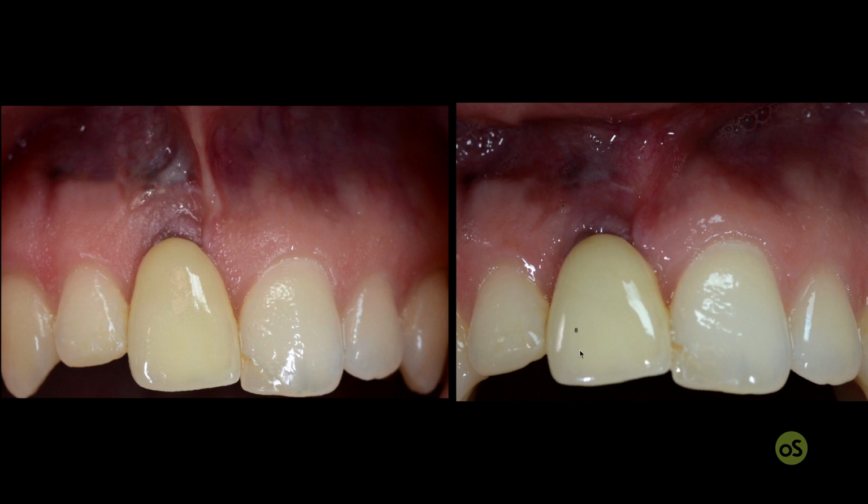This was the situation of the implant-supported crown 2.5 years after implant installation, in which the patient was absolutely not happy because of the color of the crown, the color of the soft tissue, and also because of the general bad aesthetic outcome of the surgical procedure.